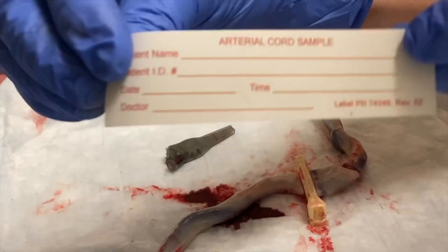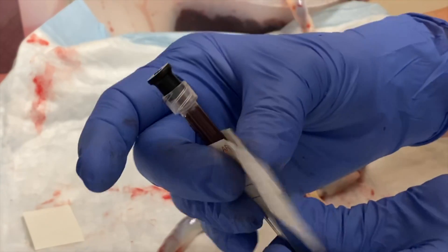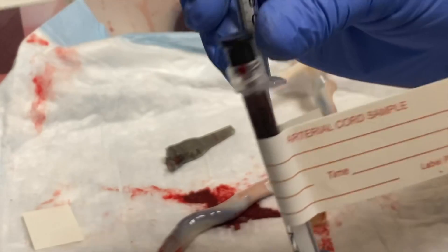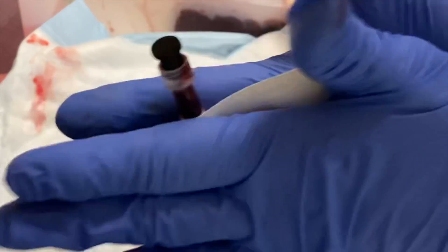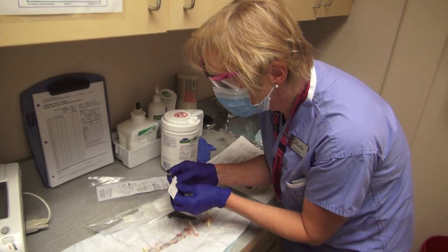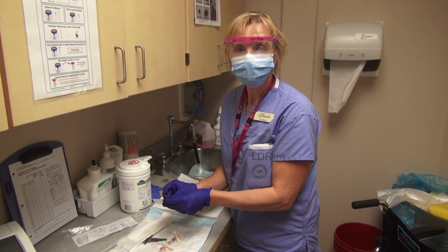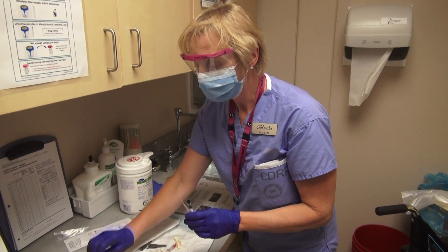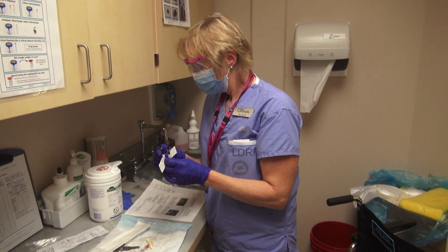Apply the artery label. Now in the newborn chart you will find a lab requisition that's already completed — you just have to put the baby stickers, the time, the date, and your initials indicating you've collected it. Do the same on these two samples: time, date collected, and put the baby sticker on the back. Give them a roll just to make sure everything is well circulated. At the nursing station there are newborn charts that are pre-bundled with a lab req that says blood gases. Put your name, the time, and the date, and bring it down to the lab to put in their unprocessed fridge section.